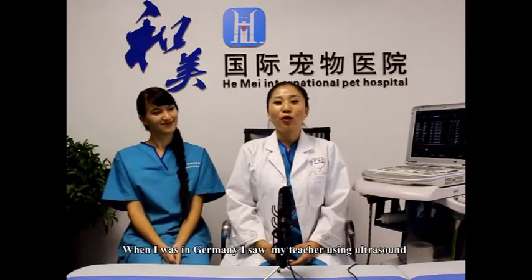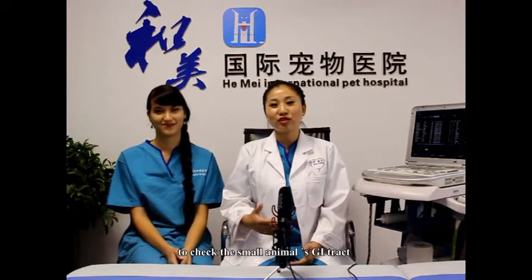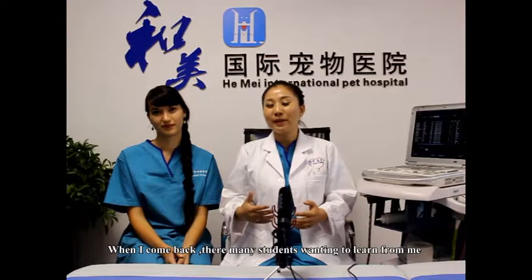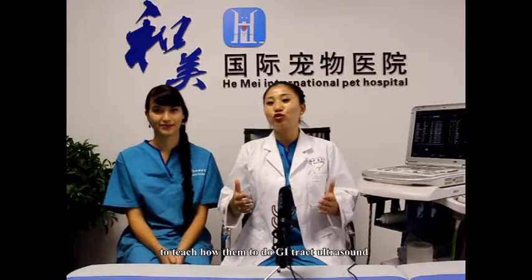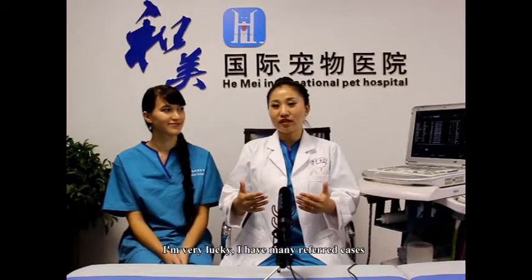Yeah, that's true. When I was in Germany, I saw my teacher use ultrasound to check the small animal and the GI tract. And when I came back, there were many students who wanted to learn from me, and also many companies wanted me to do lectures to teach them how to do GI tract ultrasound. And also, I'm very lucky. I have many referred cases.